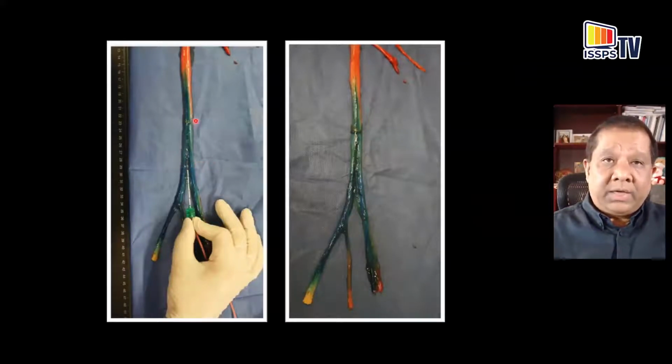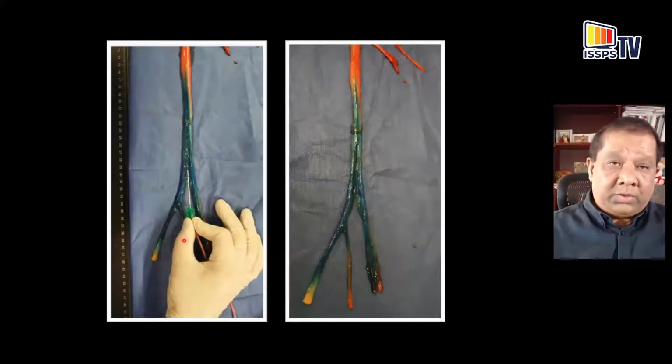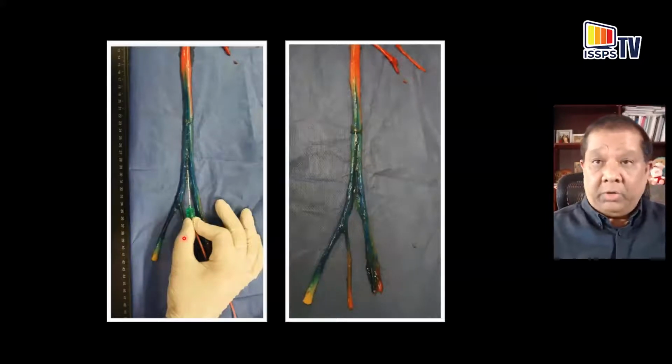But after we dissected the sciatic nerve out, this is just to illustrate where the needle was placed. And you can see 10 mils of colored dye with methylene blue not only spread along the top of the nerve cranially, but also caudally to encompass not only the tibial nerve, but also the common peroneal and its branches, maybe the sural branch or its peroneal communicating branch.